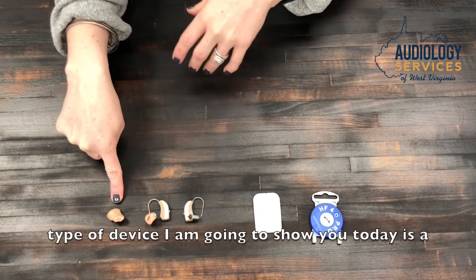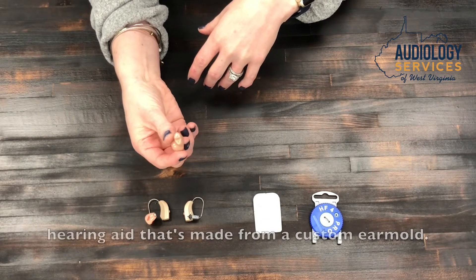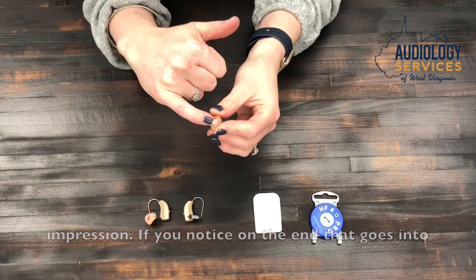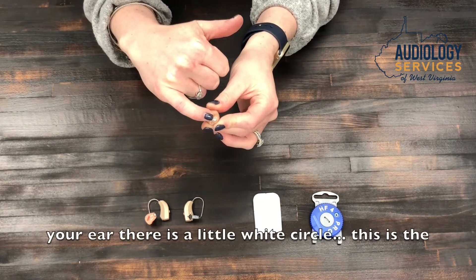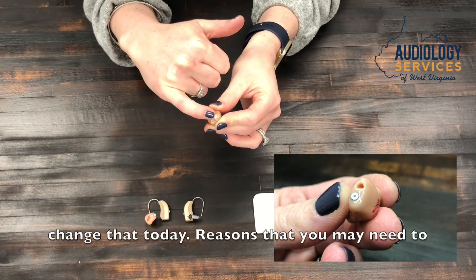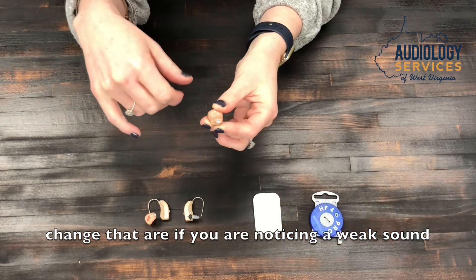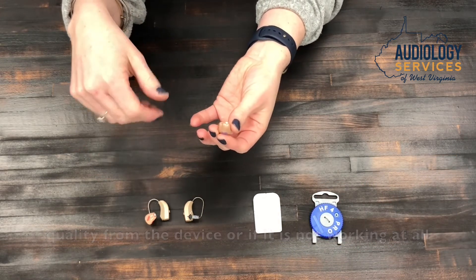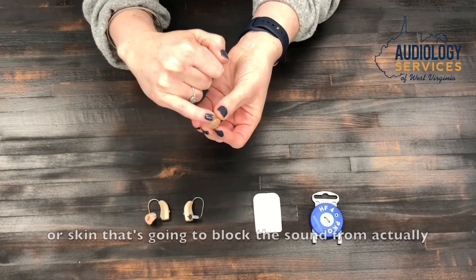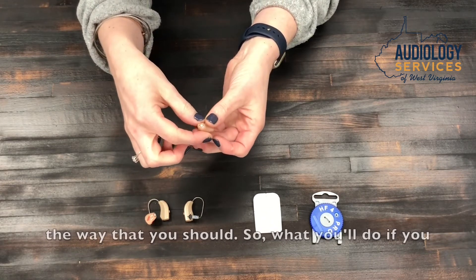The first type of device I'm going to show you is a custom hearing aid — this would be an in-the-ear, in-the-canal, or completely-in-the-canal hearing aid made from a custom ear mold impression. If you notice on the end that goes into your ear, there is a little white circle. This is the wax filter. Reasons you may need to change it would be if you notice weak sound quality or if the device is not working at all. If this gets plugged with wax, debris, or skin, that's going to block the sound from going into your ear.